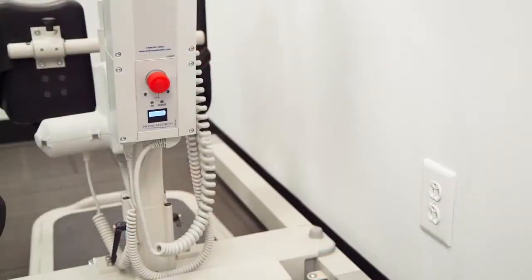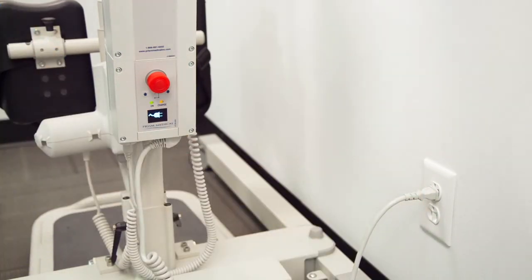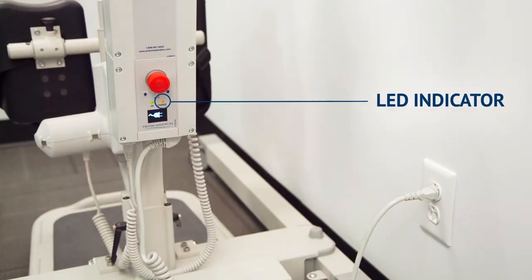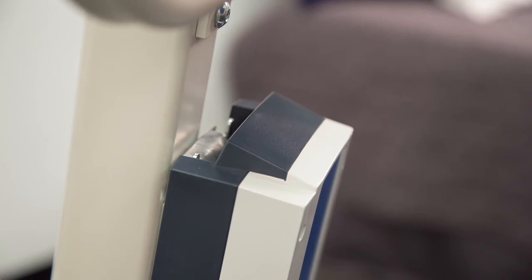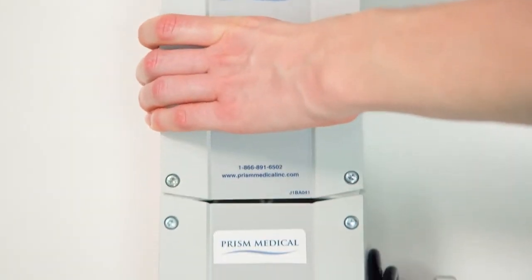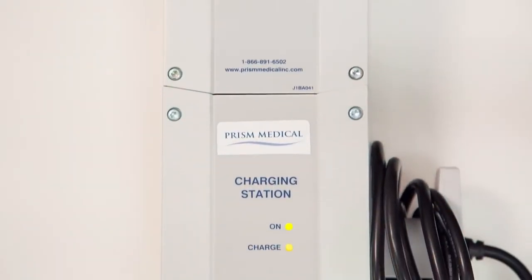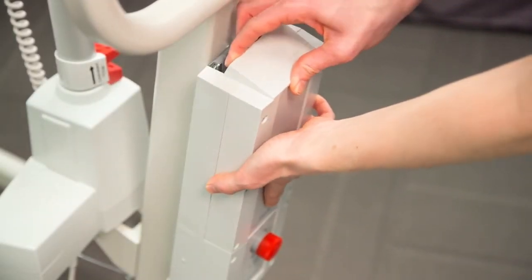Plug the lift into charge whenever it's not in use; this will allow for best battery life and performance. The orange LED light will indicate the unit is charging. At a full charge, the light will dim. If your unit cannot be plugged in, remove the battery cap, squeeze the metal release lever, and lift and remove the battery, then place it on the wall-mounted charger. Once charged, replace the battery and battery cap.